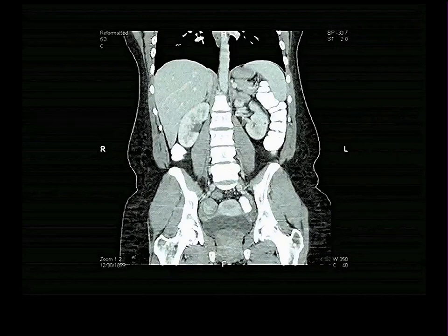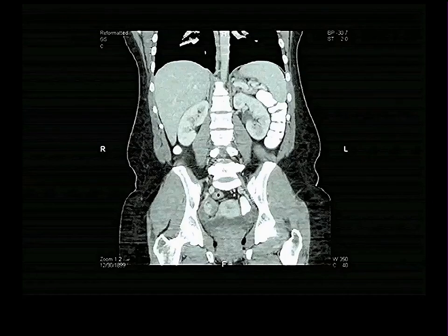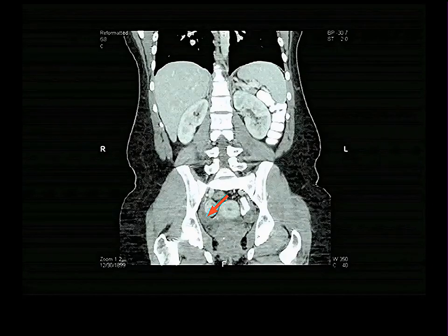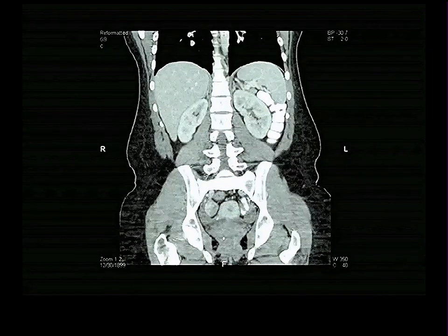Likely ovary would be my guess. No, it could be bowel. I think it's bowel. Because I think that's ovary, and that's ovary there. This has little air pockets in it, so I think it's bowel. So this must be ovary, ovary, uterus as we go backwards.